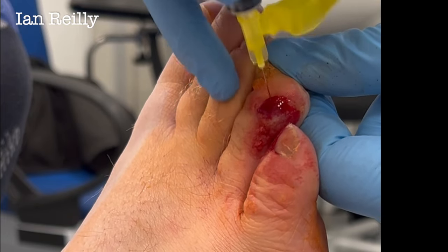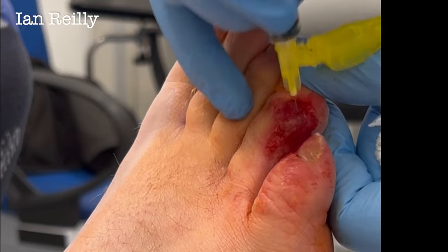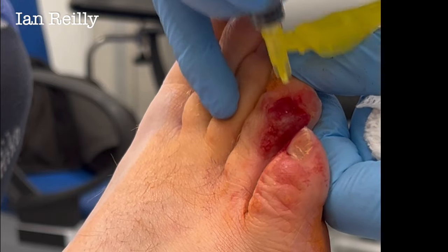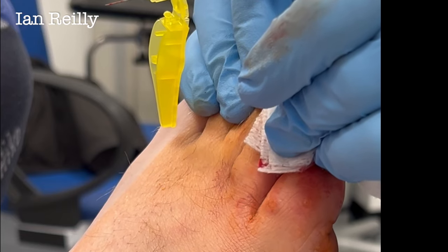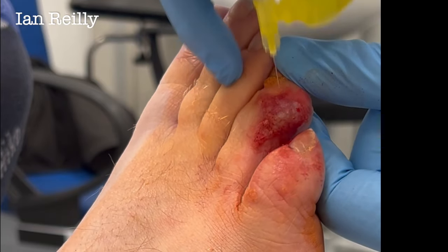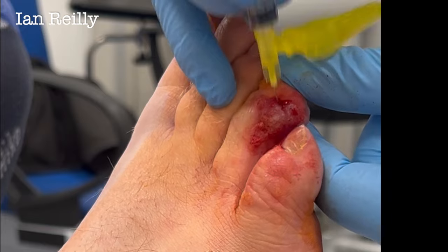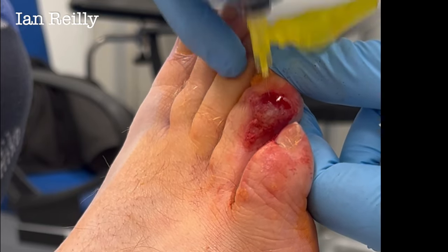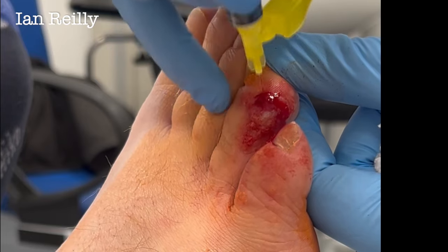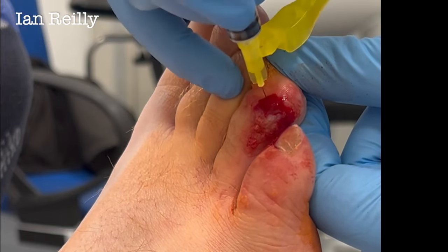So just another two hours to do — basically, that's enough. We want to create what we call a beefy red wound, so we've popped a load of cells. I like to use a nice skinny needle — I think that creates a bit more damage. I'll see the patient back in a week just to take the scab off, then leave it two months — it really takes a couple of months to kick in. Best results, which I've had quite a few times, is the whole lot goes. You can see with Kevin having quite a lot of verrucas, if I was going to do something surgical it would be a lot of trauma. While I do core excisions and verruca excisions, you can create scarring and recurrences, so for multiples in big areas I prefer to do less rather than more.